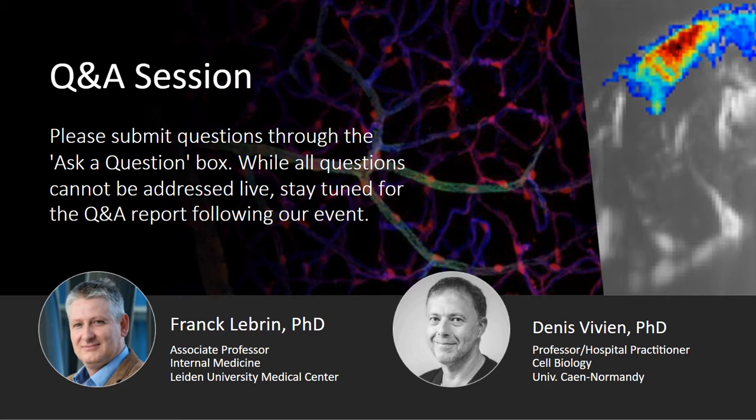And about fast ultrasound imaging, I think that's something that we can take to the clinic quickly, and we have a clinical investigation ongoing in collaboration with a neurosurgeon, Thomas Gabriel, in Caen. Thomas is looking at secondary ischemic lesions following intracerebral hemorrhages, and he's going to use fast ultrasound imaging to follow vasospasm and secondary brain injury.